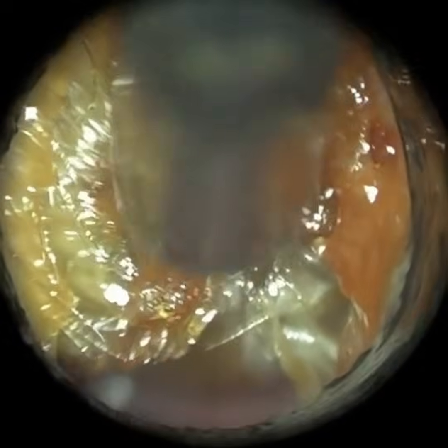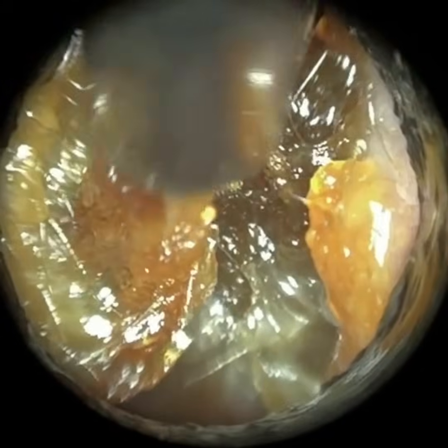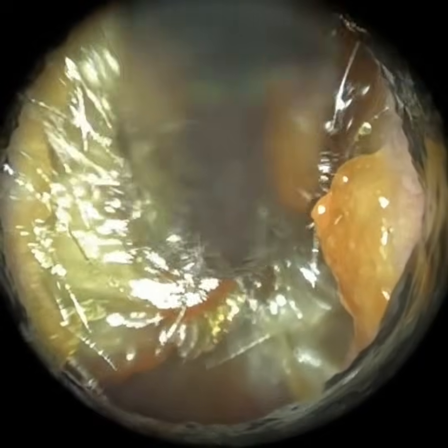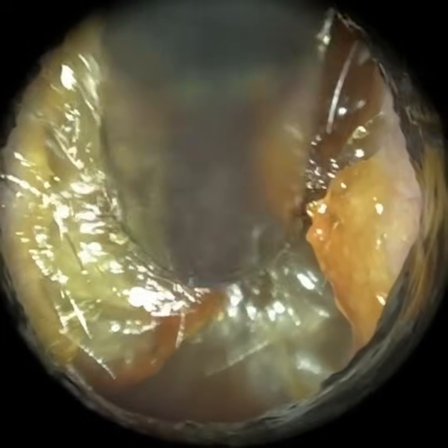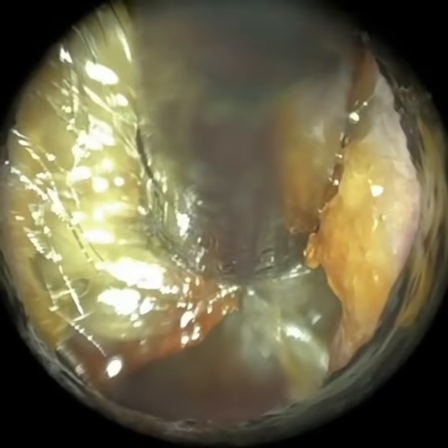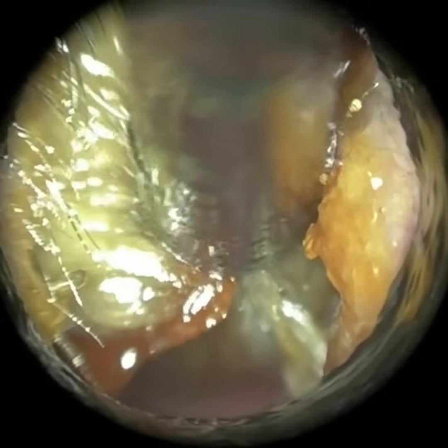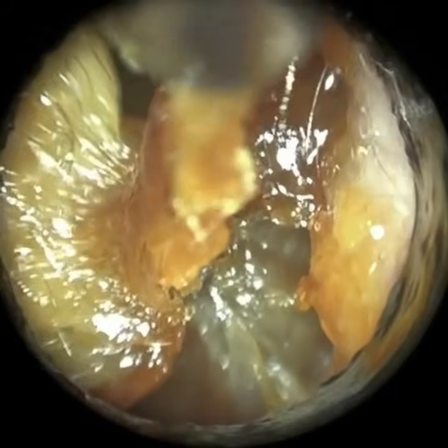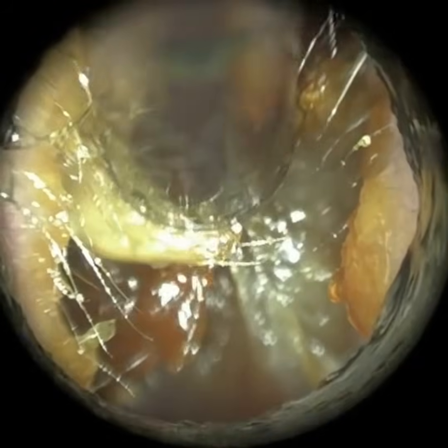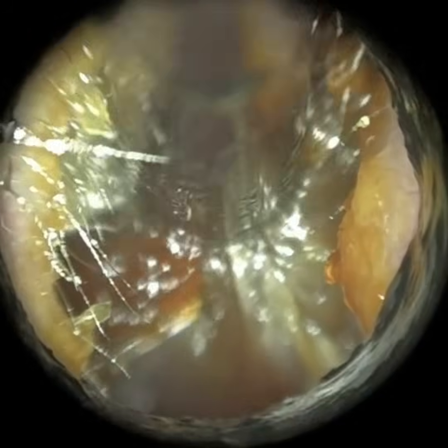So as we approach the eardrum, the ear canal narrows. Typically at the base of the ear canal, it goes up slightly, and on the right-hand side of the ear canal it goes towards the midline. Then about half a centimetre away, the ear canal at the front veers off to the right, in the case of the right ear. If it's the left ear, obviously it'll be to the left.